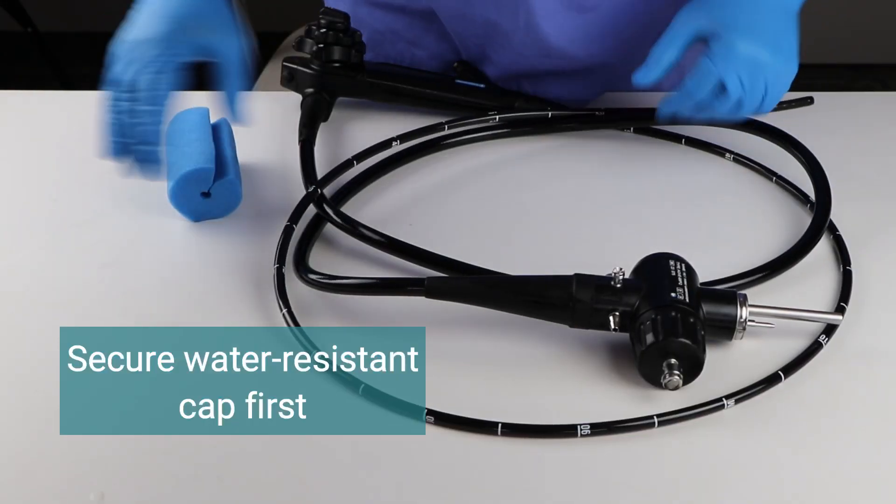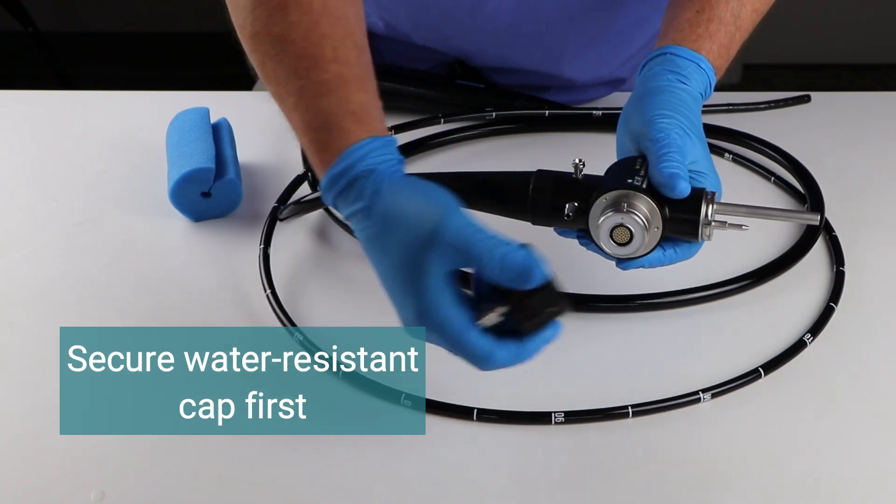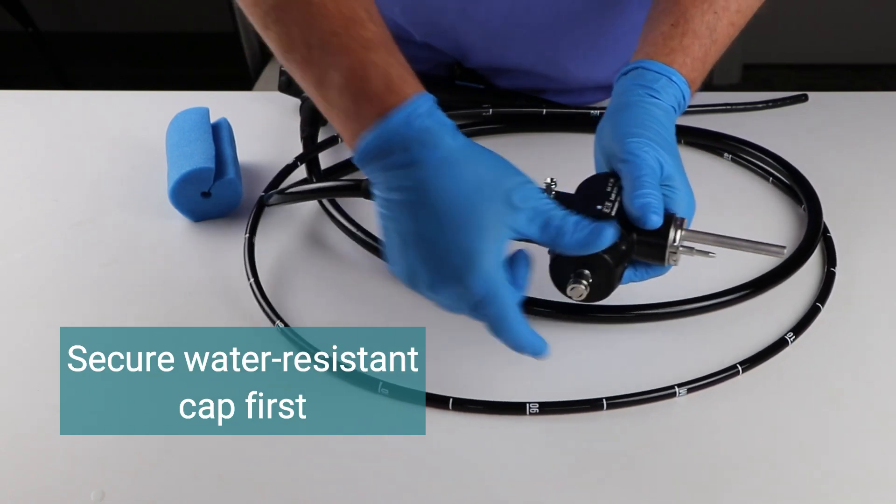Before starting, ensure the water-resistant cap on the endoscope is secure to prevent fluid from damaging the sensitive electronic parts inside.